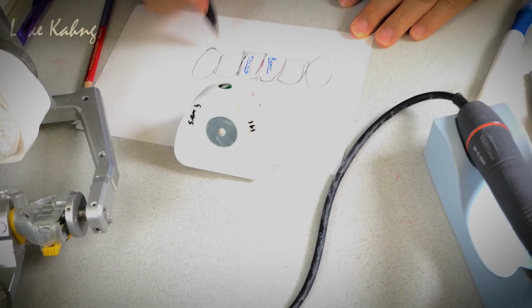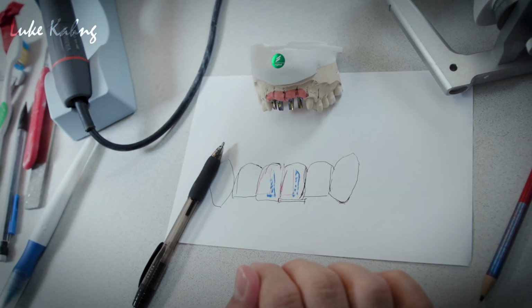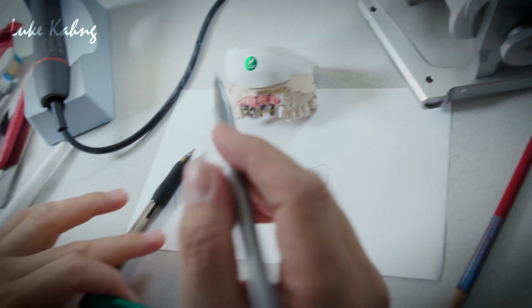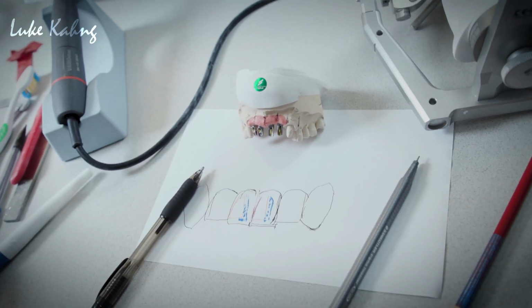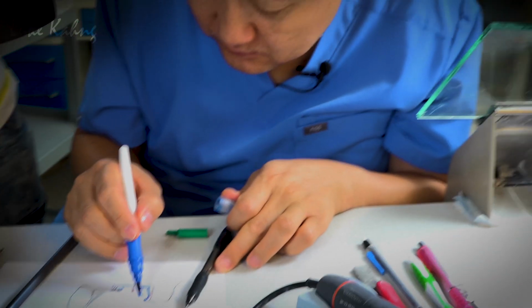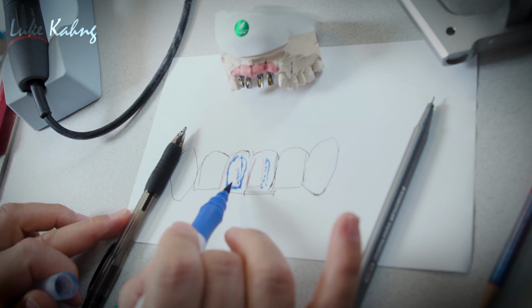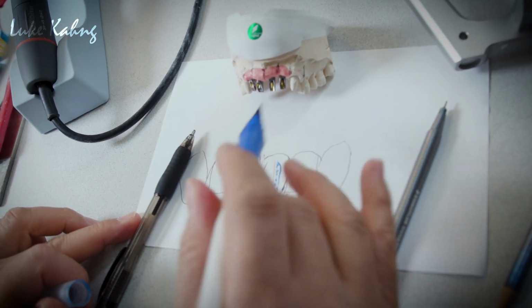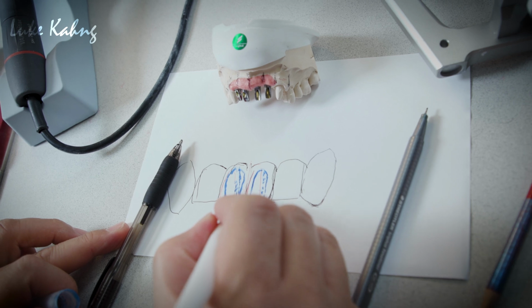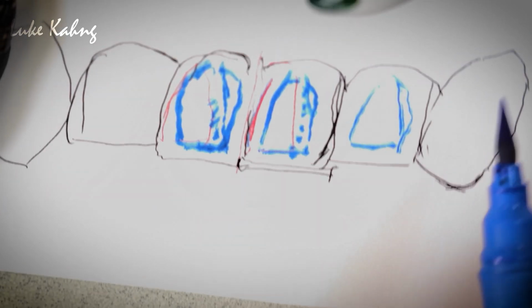This is very imperative. Okay, so we're talking about the internal framework. It's supposed to be a framework like this. This is the final framework, which is the abutment. Very good. Then we make the cap, and then we finish the final. Same thing here. I have to make this. Okay, this is the implant. Same thing here. I want to get the position. I'm talking about the implant abutment.